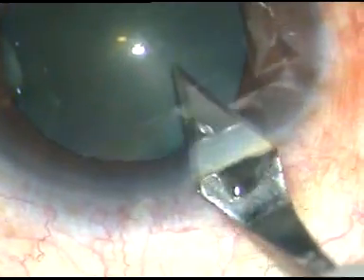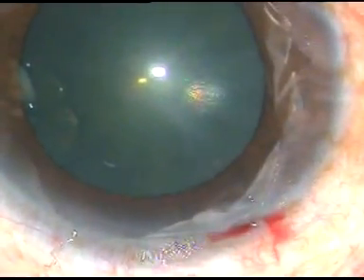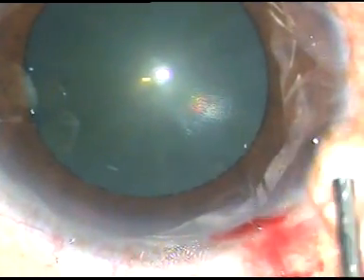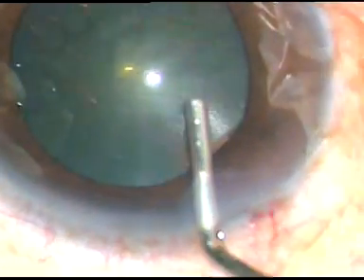Dear colleagues, this is a soft cataract and the patient had intraoperative floppy iris, which was noted during management of the nucleus. I have taken up this case for surgery. Let us watch the surgical steps.